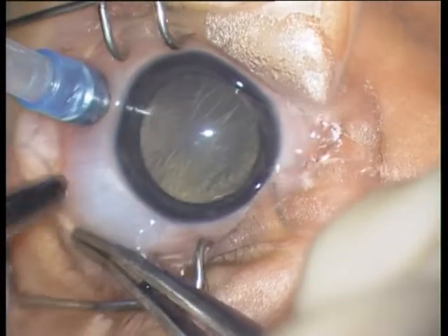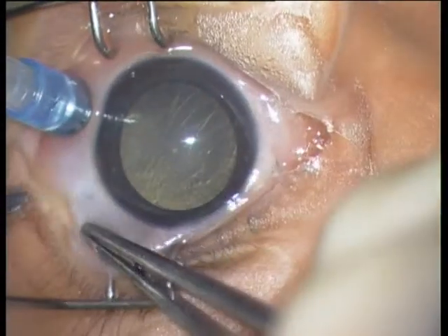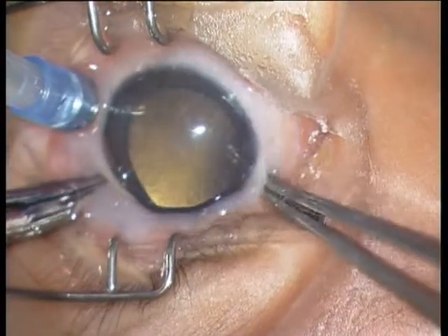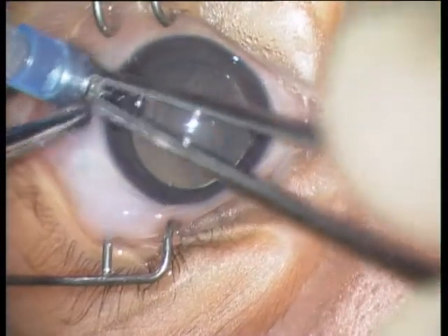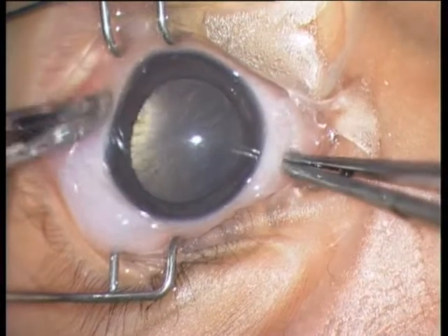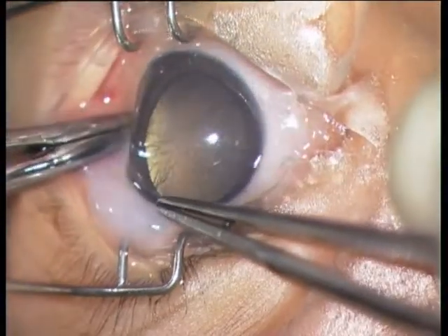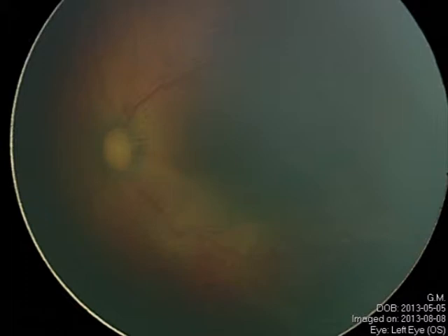There is a little bit of leakage from the sclerotomy. I placed no suture, no stitch on the sclerotomy. The next day the globe was completely normotensive and the conjunctiva was completely white. So it's a very atraumatic procedure — a minimal surgery with a happy end.